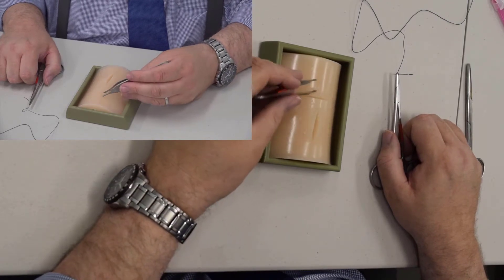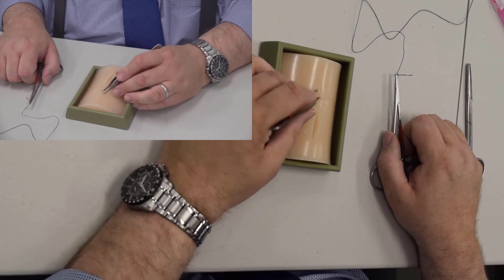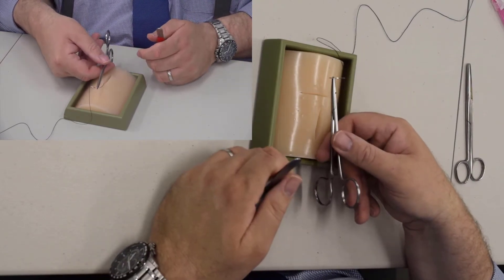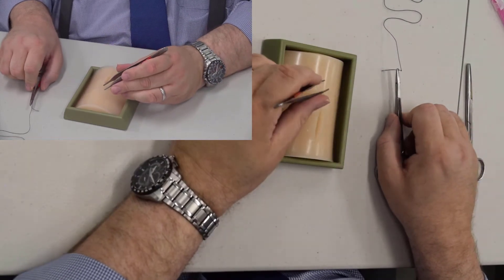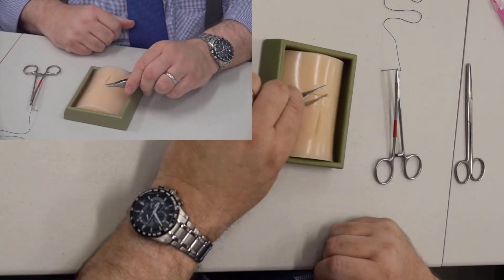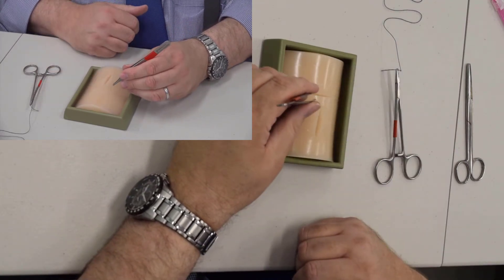They're called an Adson forcep — A-D-S-O-N. The proper way to hold the needle driver, the proper way to load your needle, and when you hold your forceps, hold them like you would a pencil. Do not hold them like this — that's wrong. Hold them like a pencil, like this.